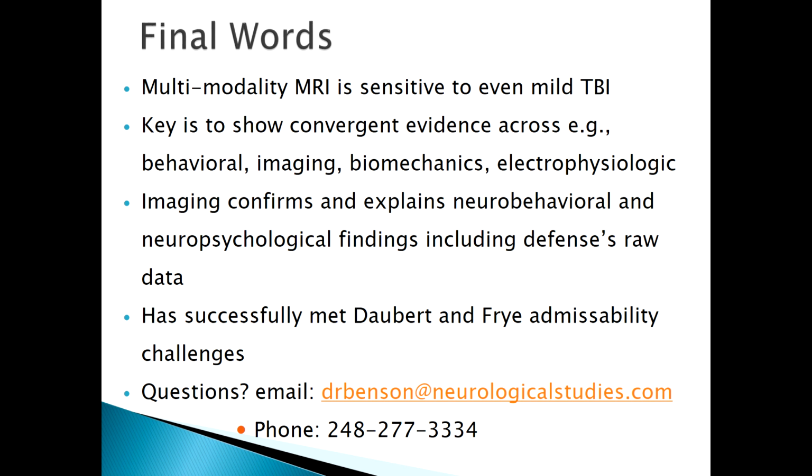If the question is, will DTI be abnormal or show evidence in concussions, if concussions are defined as mild TBI and used interchangeably, then in terms of DTI, we don't necessarily know what the absolute sensitivity is.